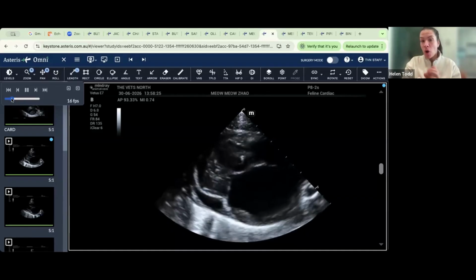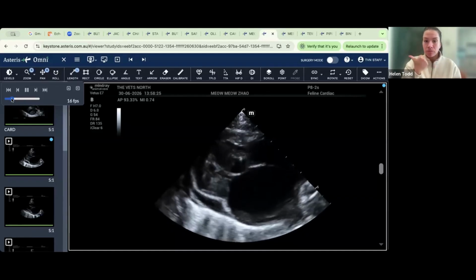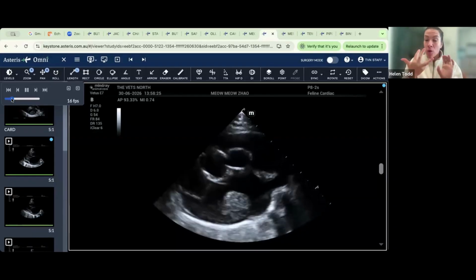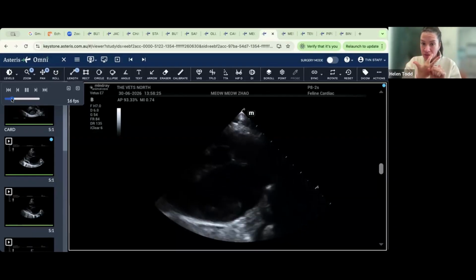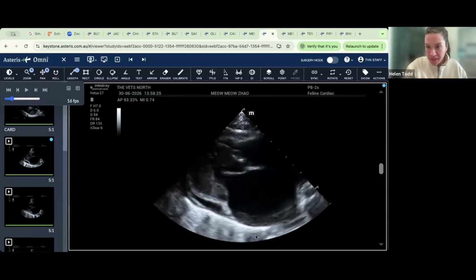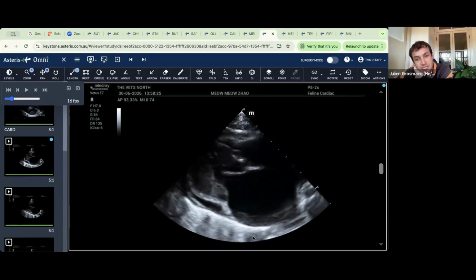Beautiful. So in this view, we've got a massive left atrium. We've got a mass. We've got tachycardia, we'll add that in. We've got a pericardial effusion. And what about beyond the pericardium, down here where my cursor is? A few more B lines again. And we've got B lines. Great.